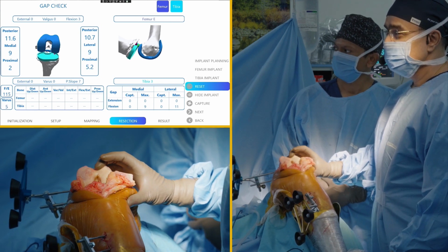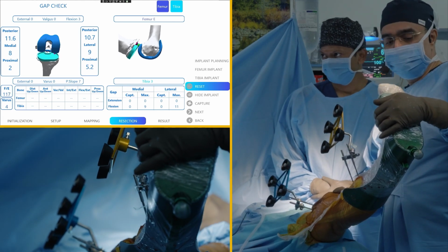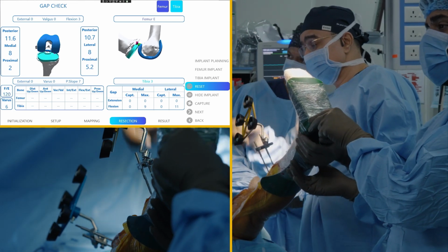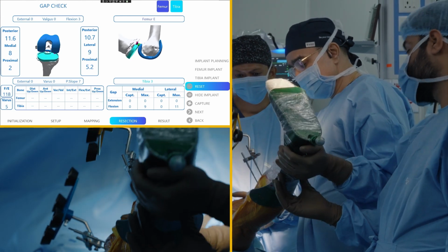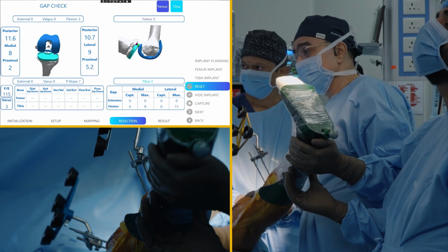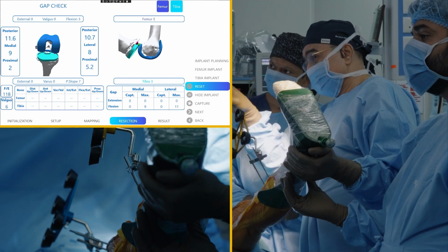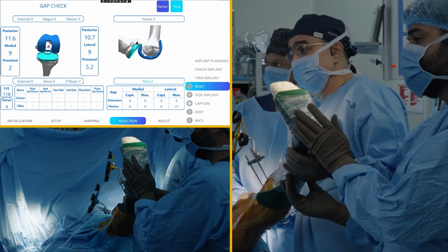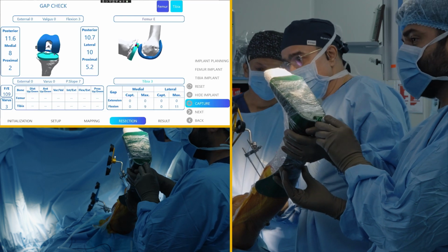Okay, so we can give a touch of external rotation slightly. Fine. So extension it is showing around -6 there. It is almost neutral, but there is definitely slight hyperextension there. As you can see, there is no fixed flexion deformity. If it would have been an FFD case, then we would have kept the gaps around 10 or 11 based on the FFD. But it is already -10 it is showing. Clinically it is around -5, 6, 10, you can stretch up to -10.